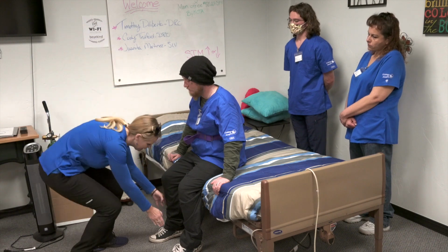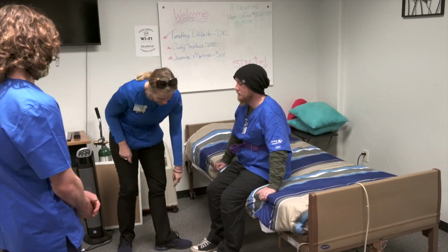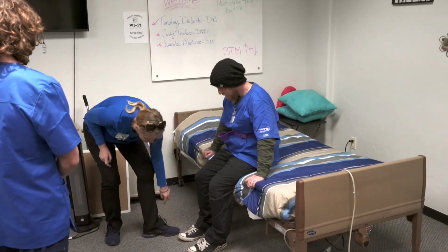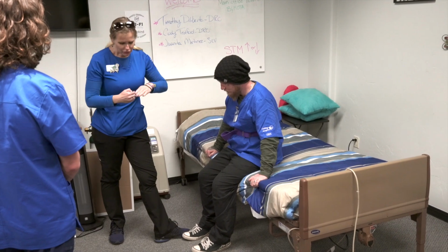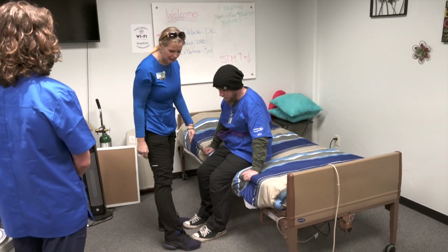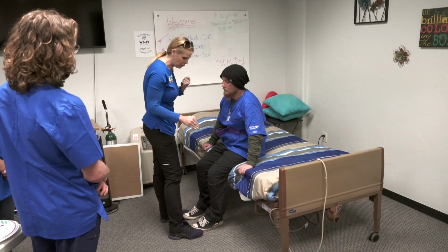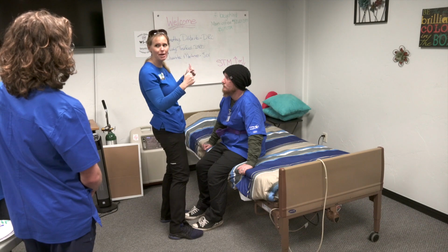So I'm gonna move his feet to where I need them. So what I'm gonna do is I am going to line up this part of my shoe with his. That way, if for some reason he starts sliding a little bit, our shoes, that friction is gonna catch us, okay? And then I'm gonna put mine here. Now, when we do this transfer, we need to remember that we are standing up, not back.